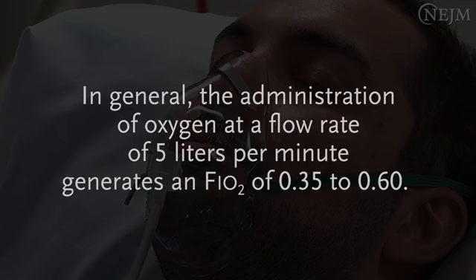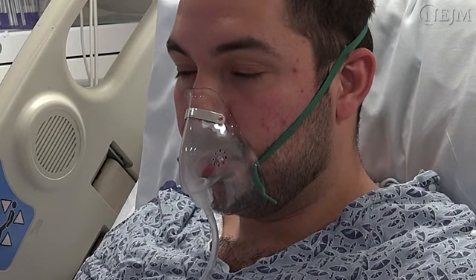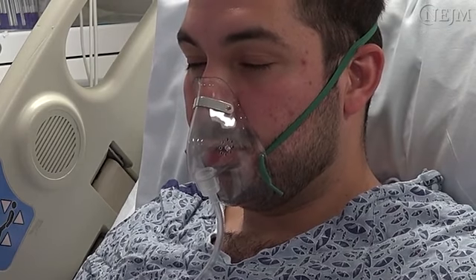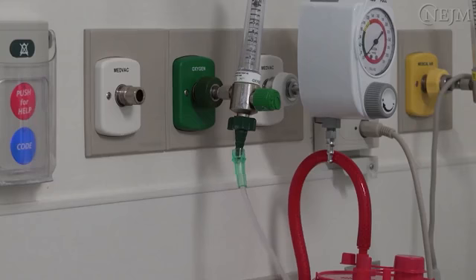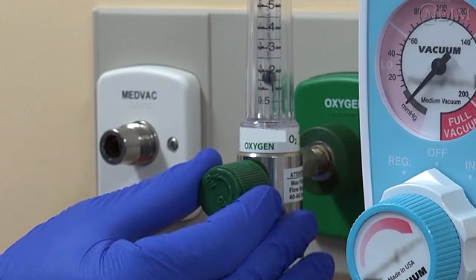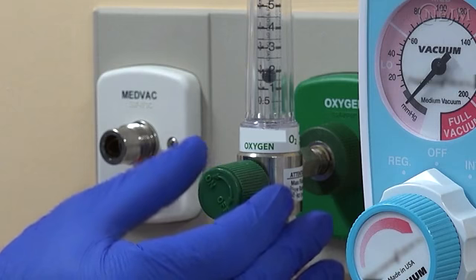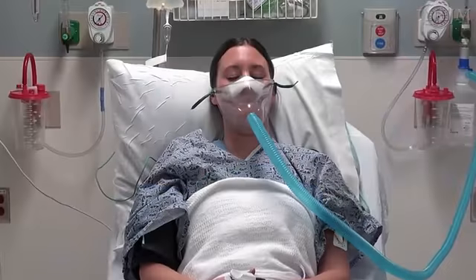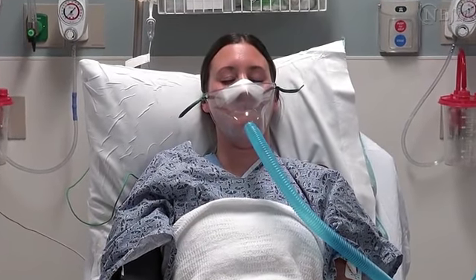to 0.6. Condensation of water vapor in the mask provides a visual cue of expiration and is rapidly cleared when appropriate fresh gas flow is provided. Disconnection of the oxygen tubing from the source or a low oxygen flow rate can cause the patient to receive insufficient oxygen and rebreathe exhaled carbon dioxide. These problems should be addressed immediately. Some patients may find that the face mask feels confining.